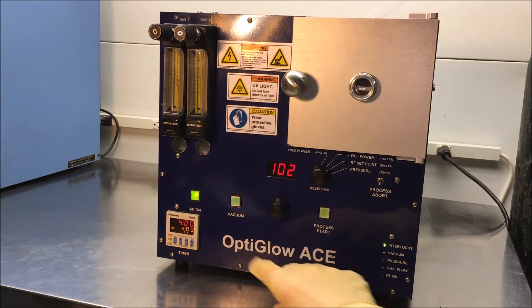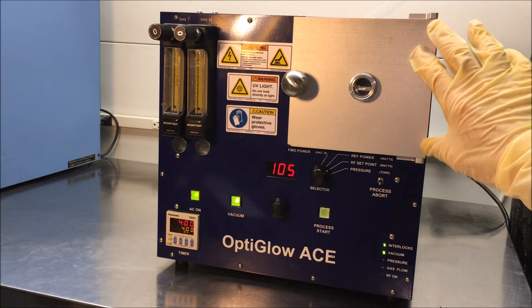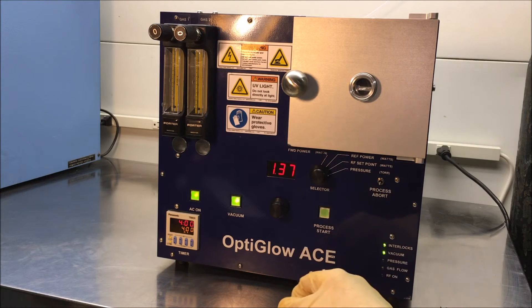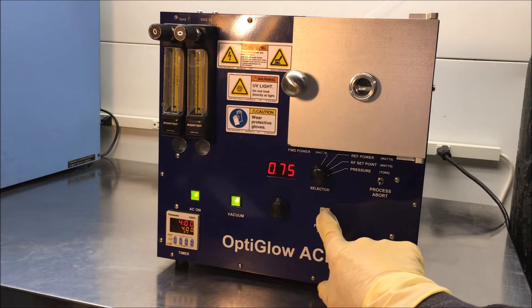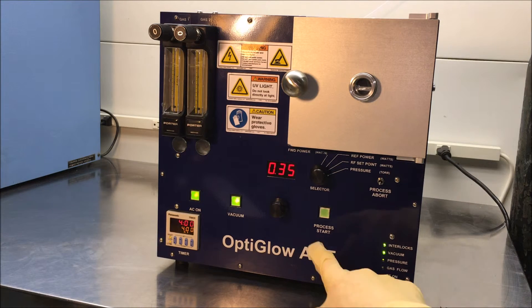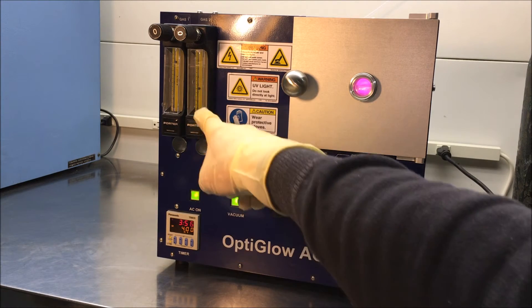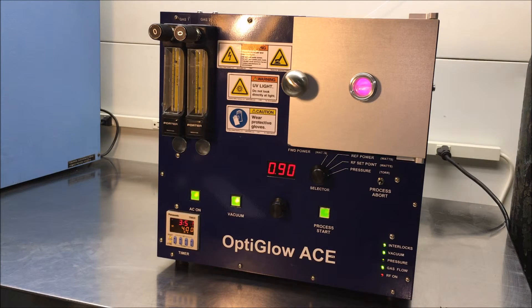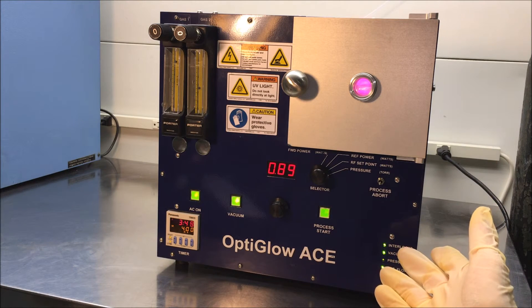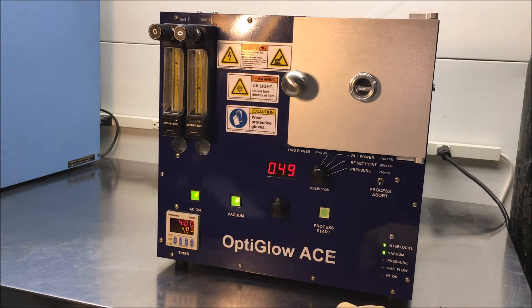So you put your samples in, you would close your door, and you would hit the vacuum. You'll notice that it sucks in — there's a dynamic offset on the hinge right here to suck straight in. Once you hit around the crossover point of 0.35 torr, you depress your process start button and automatically the system will start. You can see the flow of the gases over here and those can be adjusted however you want. After the process is timed out, the system will automatically shut off. Or if you choose, you can hit the process abort, thus stopping the process, and then come over here and press vacuum.